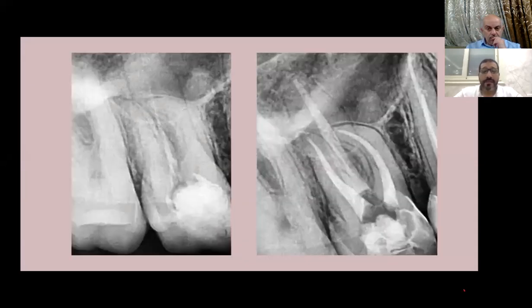first, we have to enlarge the apical size of the root canal to a suitable size. And in some cases, I do an MTA apical plug to perform an apical seal of the root canal system. And usually I use a bioceramic or even MTA sealer to try to manage such empty space at the apical third of the root canal.